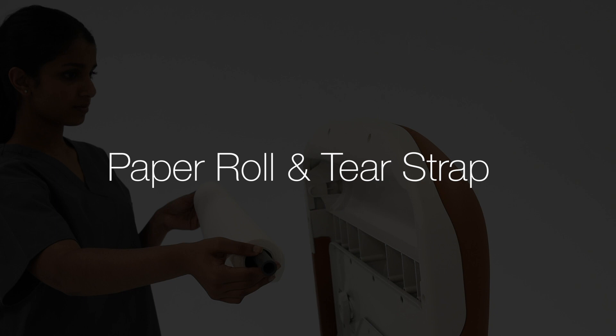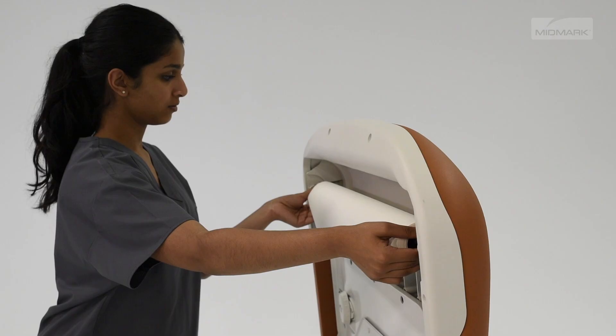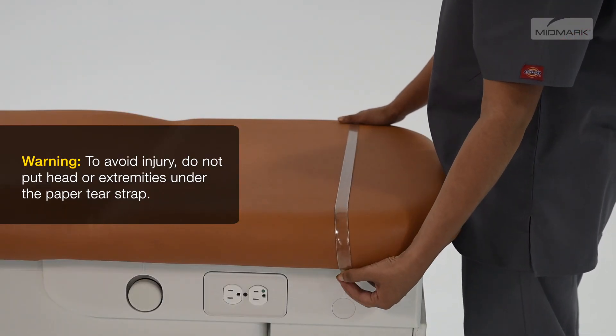To install a paper roll on the chair, insert the rod ends into the sockets under the head of the upholstery. To install the paper tear strip, attach the strap to the snaps on each side of the chair.